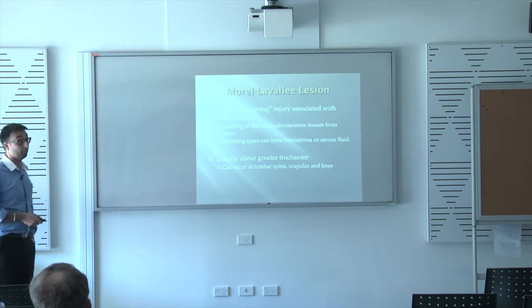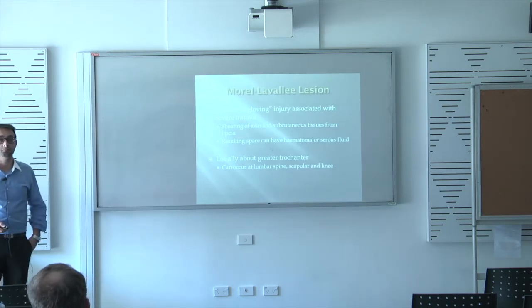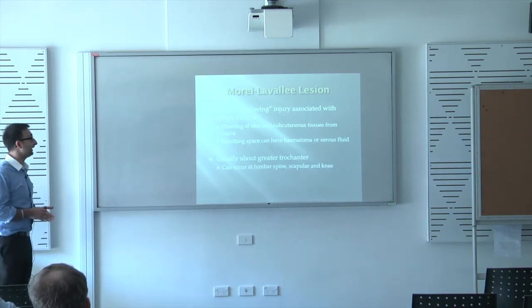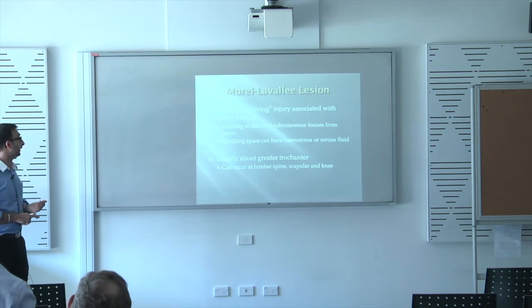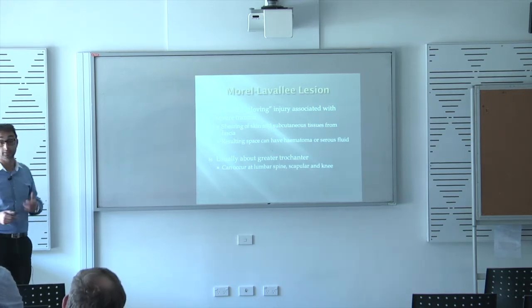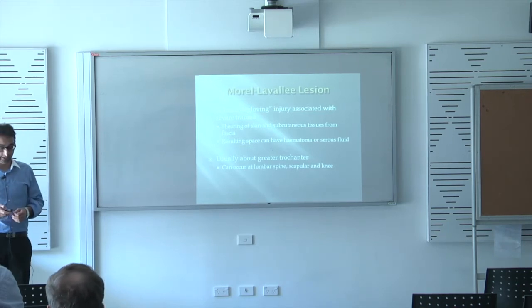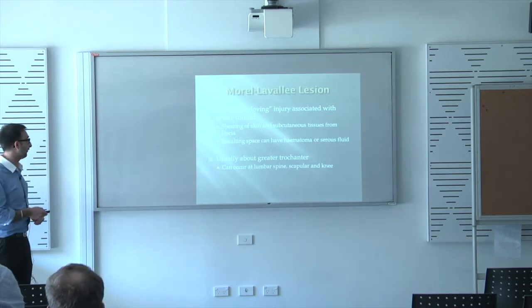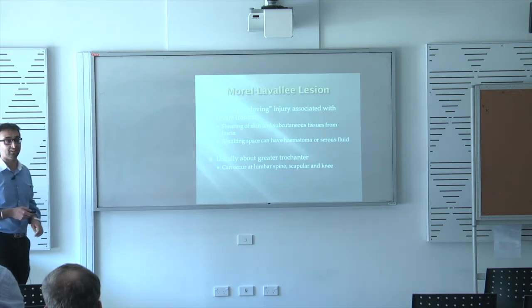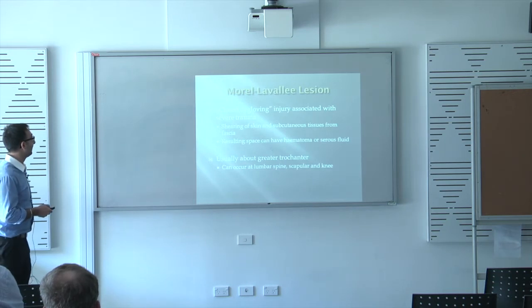So essentially it's called a Morel-Lavallée lesion. If you could take anything away from the talk, it would be this word. I think it's a great word. It's basically a closed degloving injury in trauma. You get shearing of the subcutaneous space, you get a potential space, and it fills up, and it's pretty typical around the greater trochanter. In my pan scans, this will be my first review as a greater trochanter to diagnose one of these. It would give me great satisfaction to put this in the comments at the end of the report.